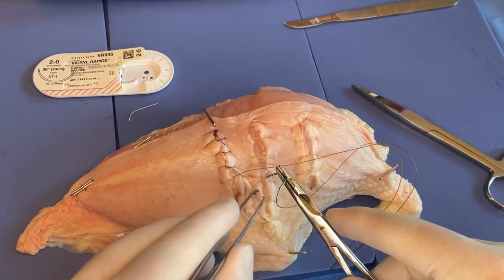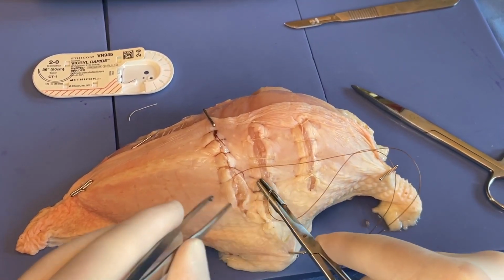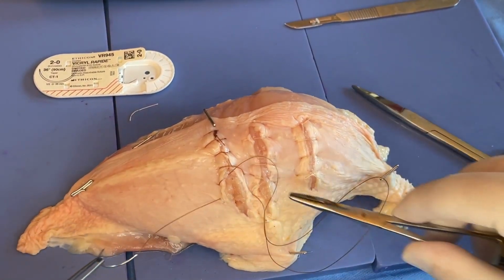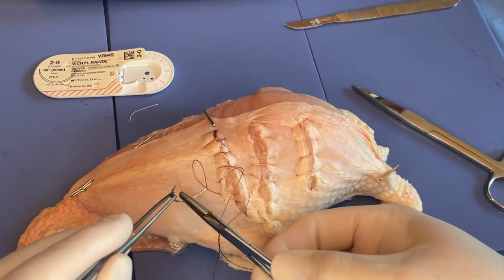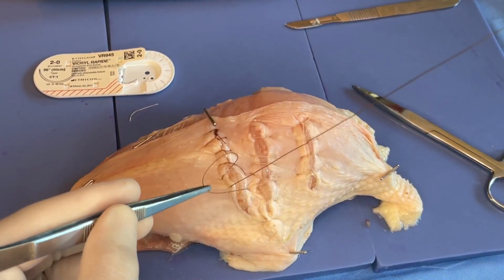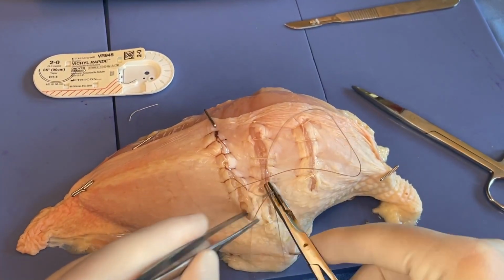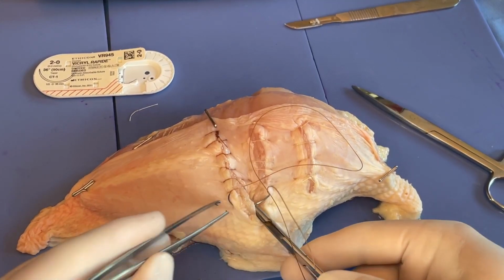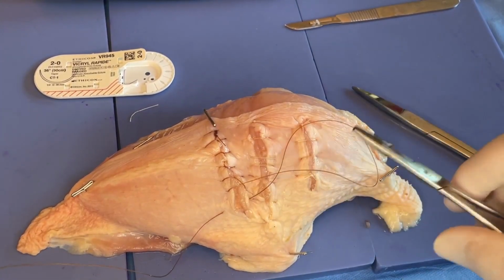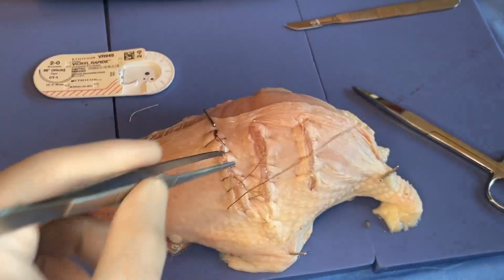And let's see, we'll again grab that skin edge and try to pull it over a little bit better, come out in the middle, come through our loop to reload. So a lot of people have questions about how you finish up, so I'm just going through the loop, grabbing the needle, pulling the needle out there.